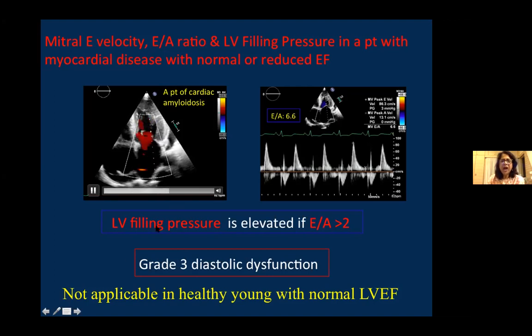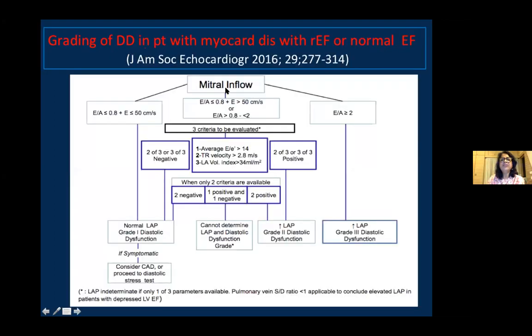But there are situations where only by looking at the mitral inflow, we may not be able to say which grade of diastolic dysfunction the patient is having, or whether the patient is having elevated LV filling pressure.